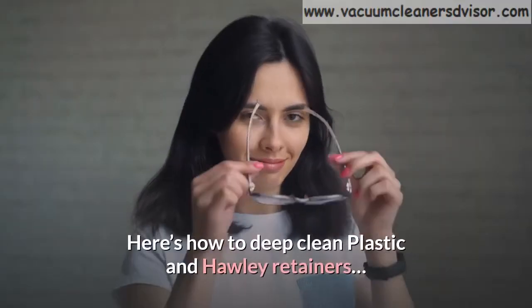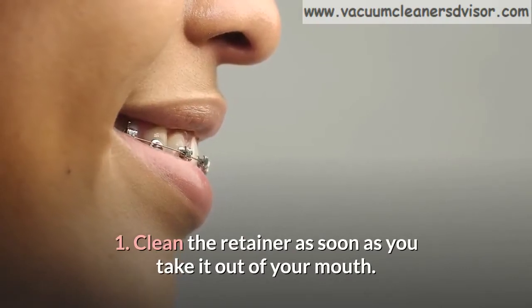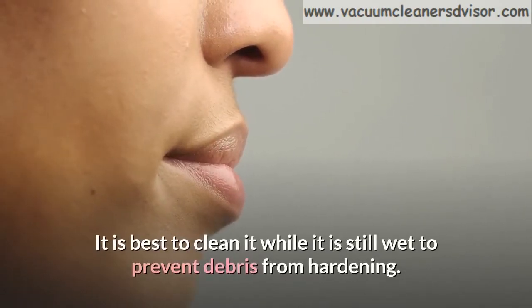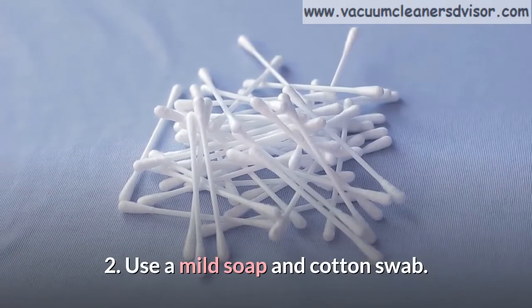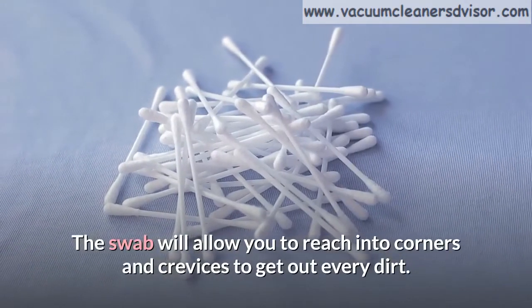Here's how to deep clean plastic and Hawley retainers. Step 1: Clean the retainer as soon as you take it out of your mouth. It is best to clean it while it is still wet to prevent debris from hardening. Step 2: Use a mild soap and cotton swab. The swab will allow you to reach into corners and crevices to get out every bit of dirt.